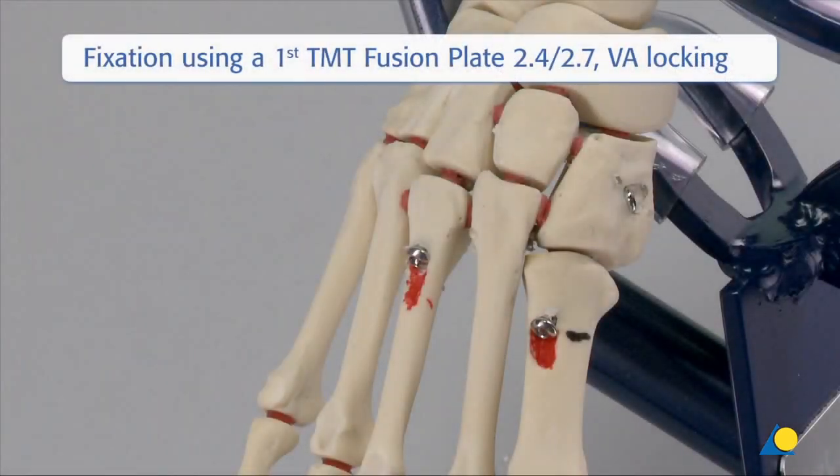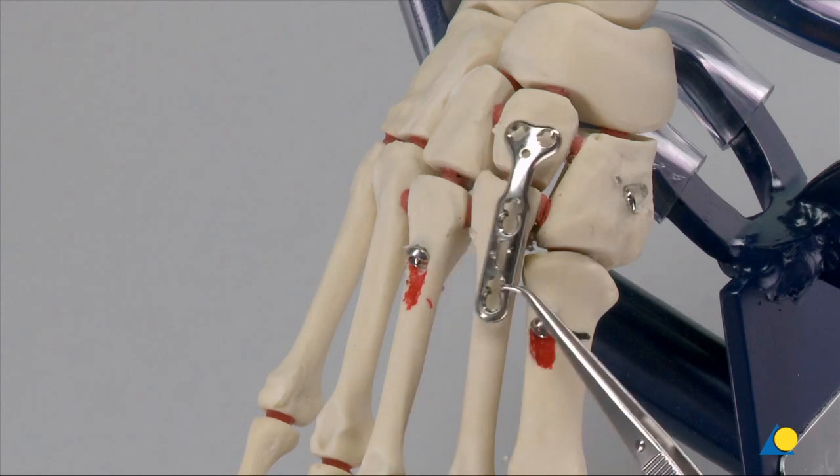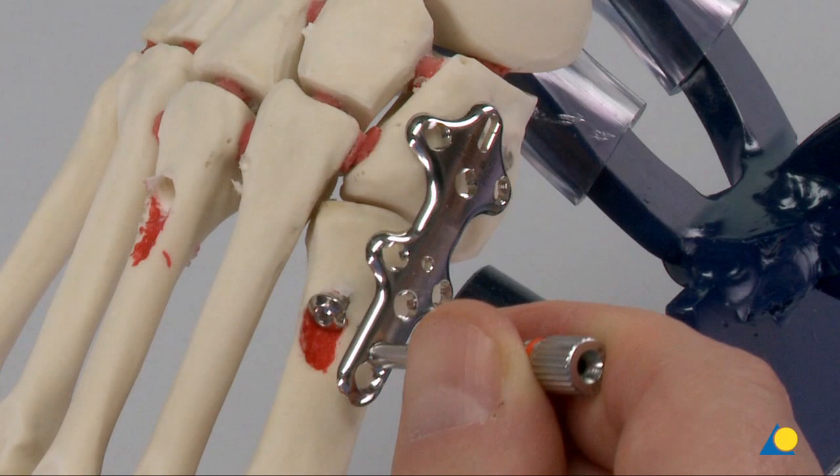If there is comminution at the base of the second metatarsal that precludes the use of a screw from the medial cuneiform to the second MT, a dorsal spanning plate may be used. Plates can also be used to salvage a failed pocket hole. The plates include the TMT fusion plate 2.4-2.7 VA locking and the first TMT fusion plate 2.4-2.7 VA locking, which will be shown.